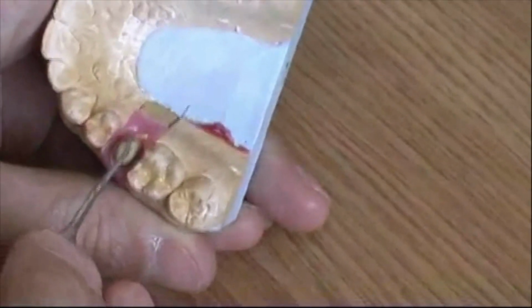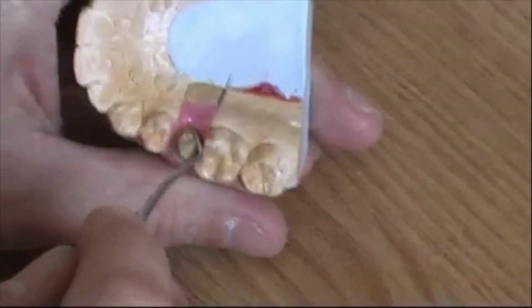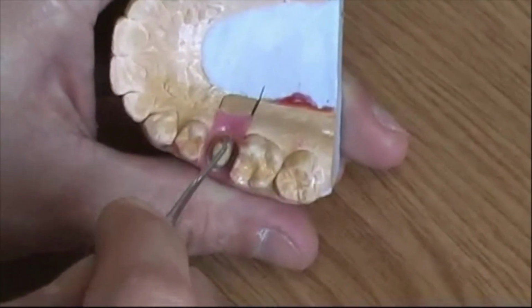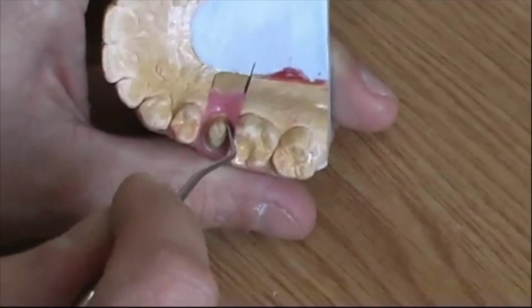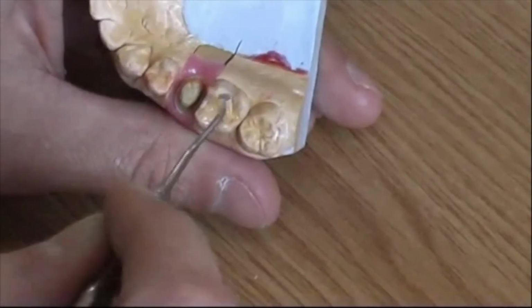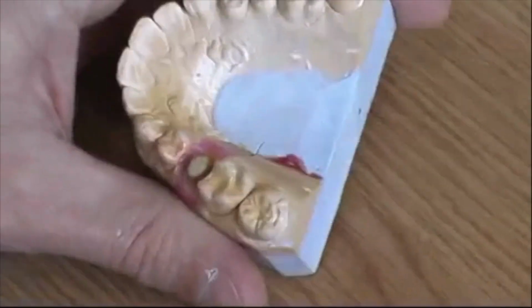Now the problem is, you see, this retraction cord is white. And if you have a little bit of bleeding, it becomes pink. If it's pink, you don't see it, because gum is pink. And that's why I prefer retraction cords that are black or green or blue. Yeah, something that makes contrast with both dentin, which is yellow, and with gum, which is red, pinkish. Anyhow, so now we placed it.